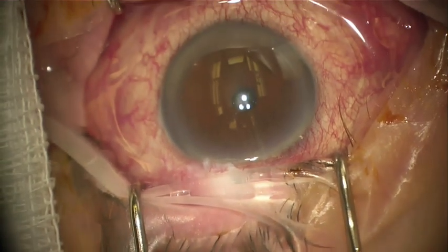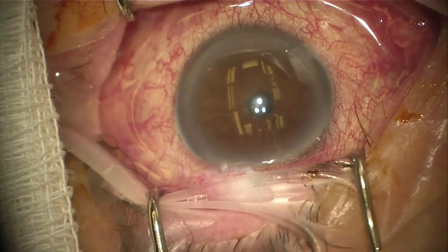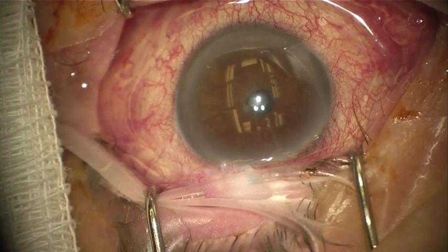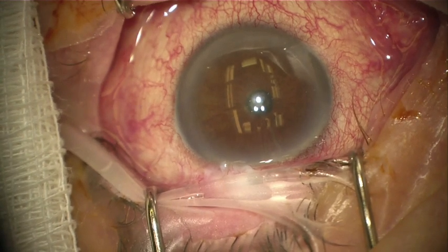On a separate day, I similarly approach the left eye. Since I am a superior sitting surgeon and comfortable performing cataract surgery with nasal incisions, I also use the same approach for the Durista implantation in the left eye for the supine position.